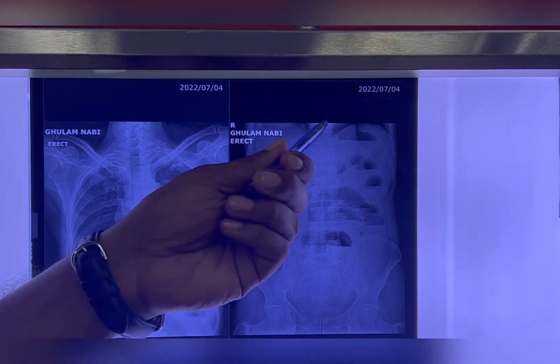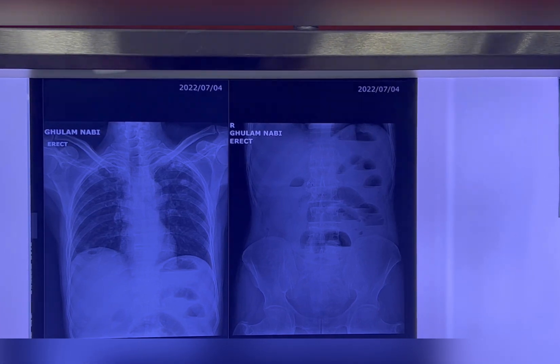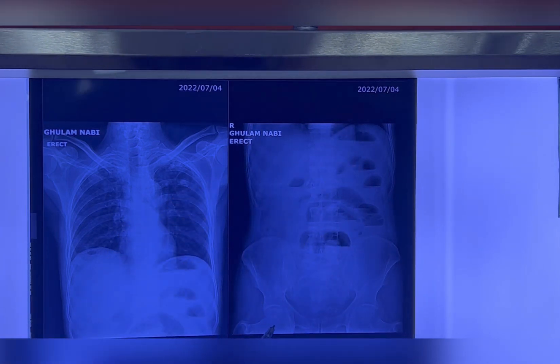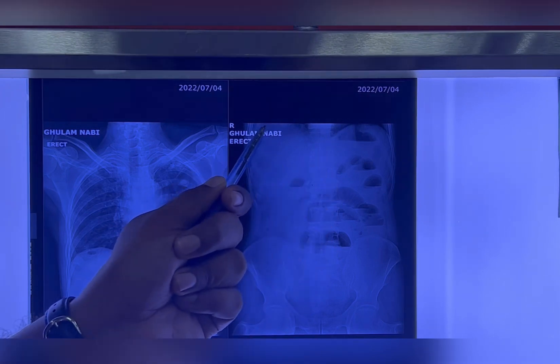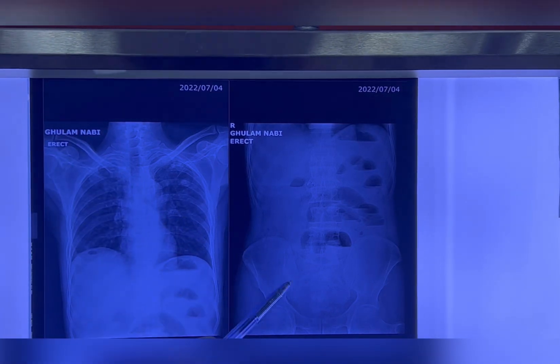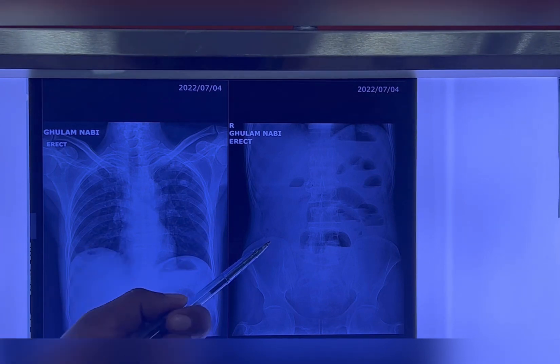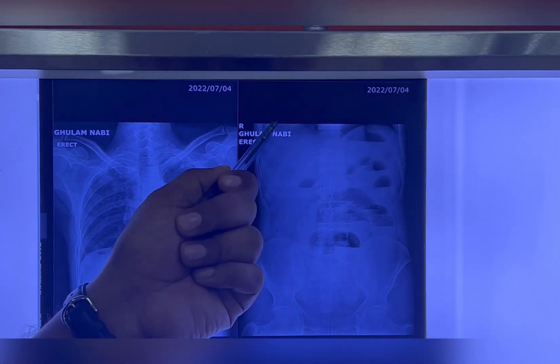This is a proper abdominal X-ray. Before looking at any abdominal X-ray, it is mandatory to check whether that X-ray is proper or not. A proper abdominal X-ray should include both domes of the diaphragm and the pelvis. This is the left dome of the diaphragm, this is the right dome, and this is the pelvis. This is an AP view — anterior-posterior view — because in abdominal X-ray we go for AP view, whereas in chest X-ray we usually go for PA view, posterior-anterior view.